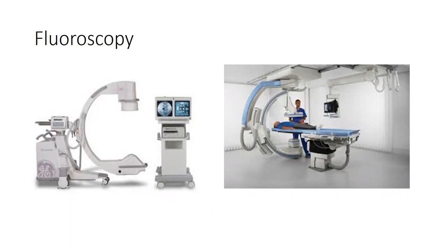People always say we got to put lead underneath the patient to protect them. Well, guess what? The lead underneath is not where they're going to get their exposure. It's actually the first bounce of the beam coming off of there. Does that make sense? So you look out for scatter, and you'll read about this process later on. But fluoroscopy is used in a whole host of settings.